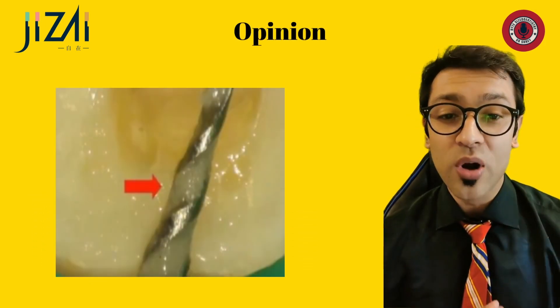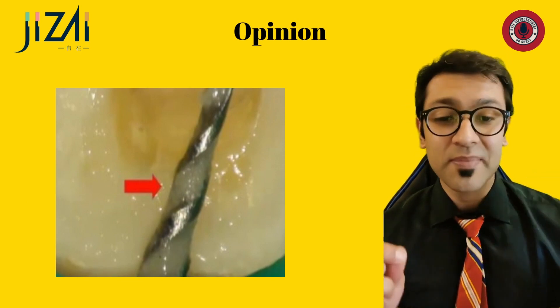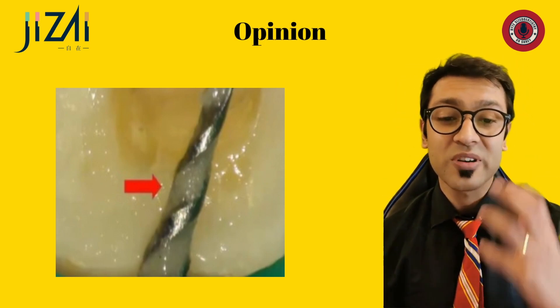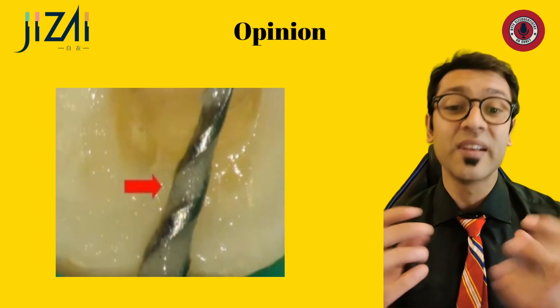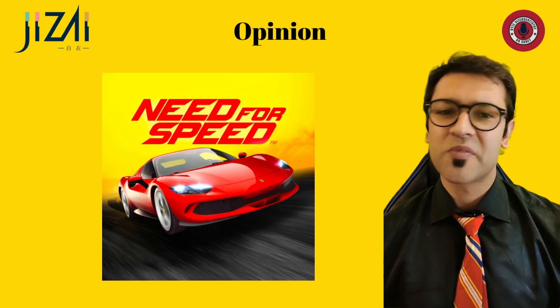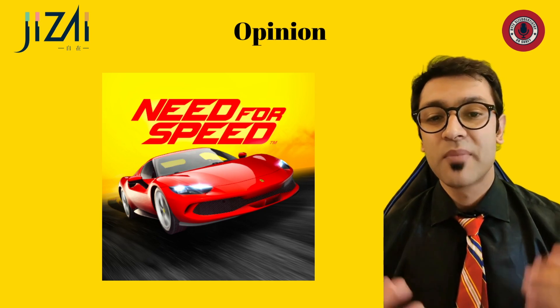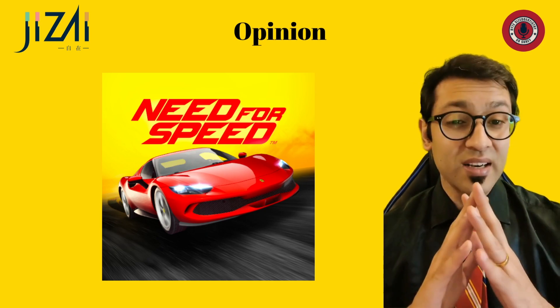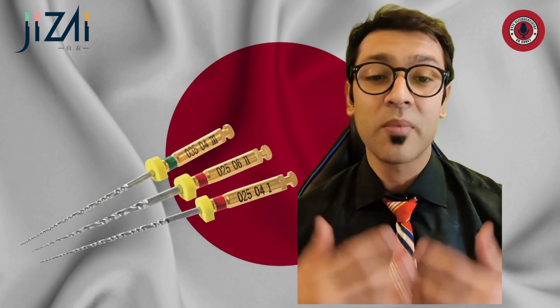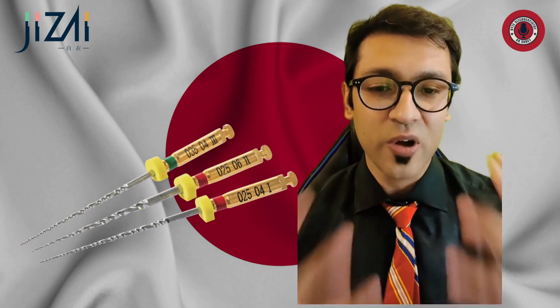Two things to note before you try this out: first, it does tend to capture a lot of debris, so it's not enough to just wipe the file on your glove — you need to use a gauze to wipe the file between uses or between entering the canal multiple times, because debris gets pocketed into the grooves. Secondly, as someone who has performed more than five to six thousand RCTs, I personally prefer more aggressive file systems because they're a bit quicker, but that takes nothing away from this amazing new system from Mani Japan.